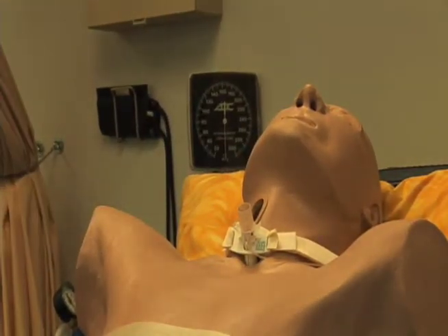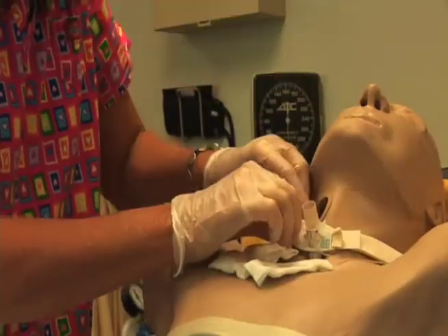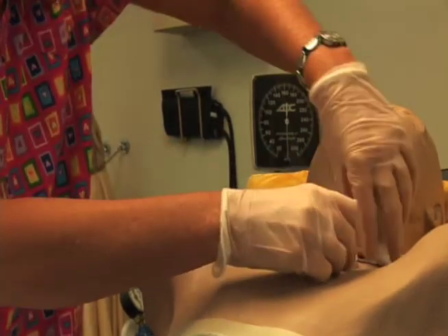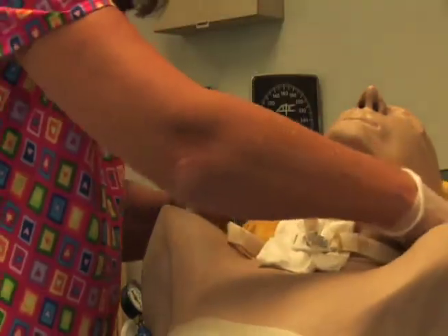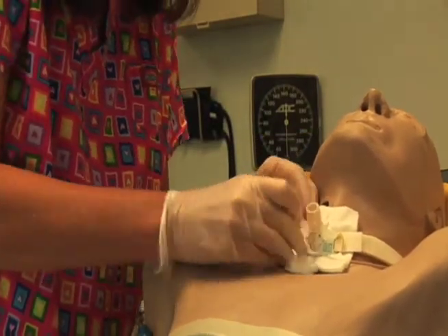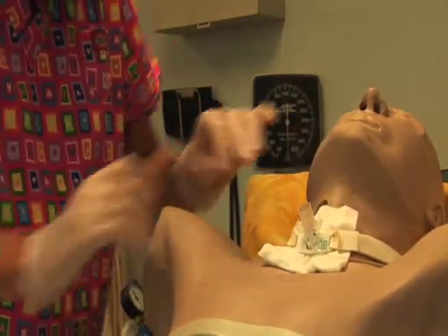And at this point you can get your new slit dressing and loosen one of these sides. You don't want to loosen both sides at the same time because you want it to stabilize on the patient. So loosen the side up and then put it back together. It's a pretty easy thing to do. Makes the patient feel a lot better.